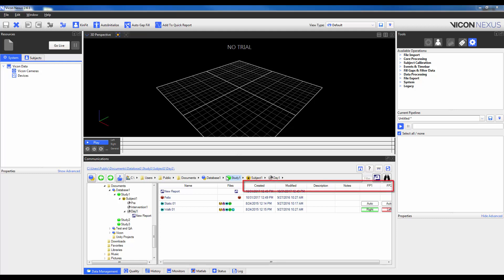The remaining columns are referred to as metadata. These can be used to provide additional information based upon a user's preference. In this particular session, we have the option of adding in a description, notes, and to allocate a foot contact to each force plate.